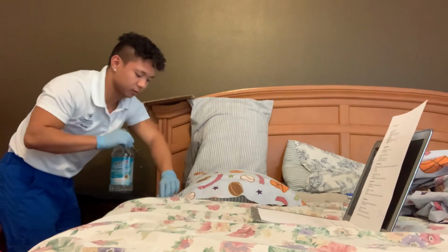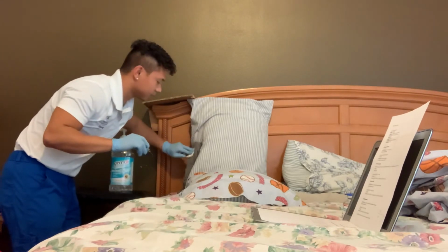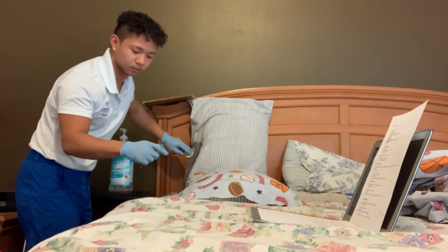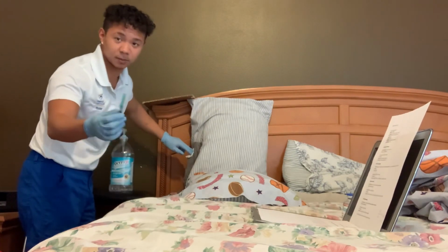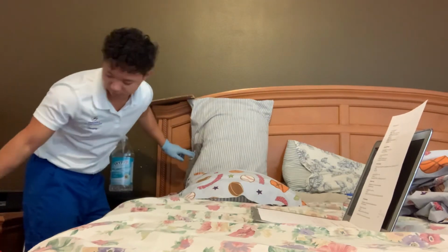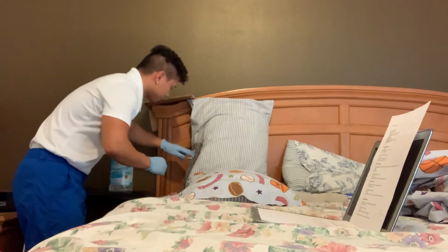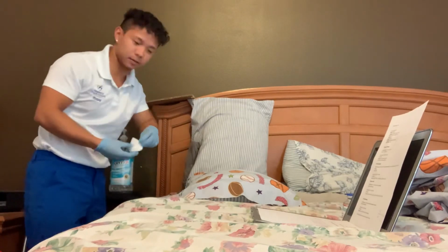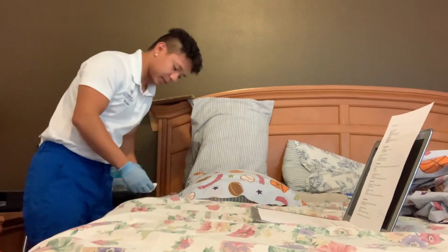And I'm going to use the gauze, and I'm going to engage the safety and dispose in the sharps bin. So the needle goes in the sharps container. And I would place a band-aid here, if I had one, until the bleeding stops.